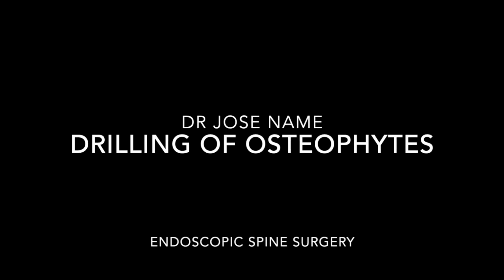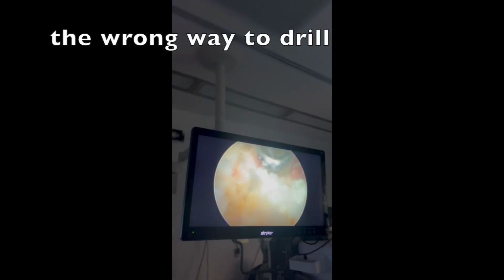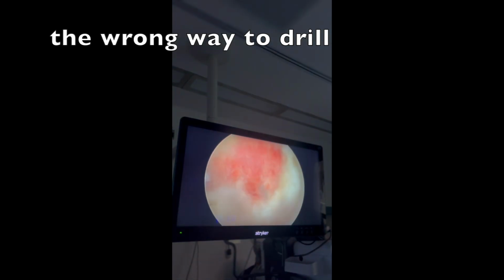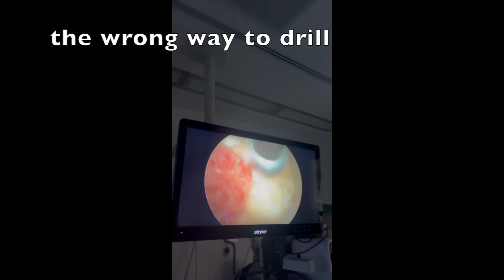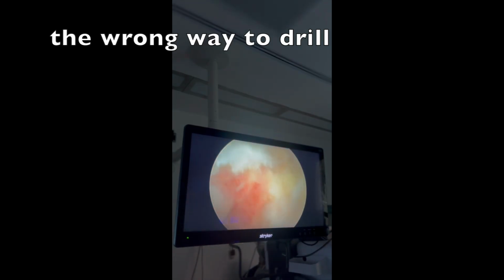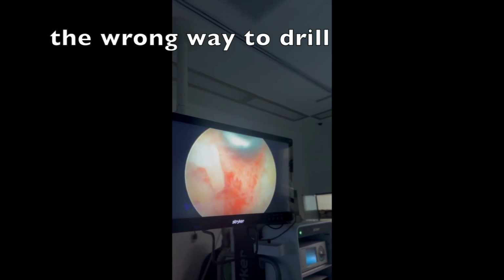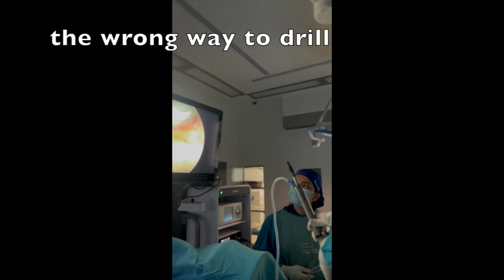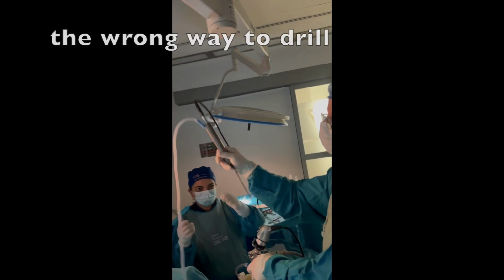I'm going to talk about how to perform osteophyte drilling when we perform endoscopic surgery of the lumbar spine. I start by showing this short video in which it shows the way I did the drilling previously, which occasionally led me to disorientation during the surgeries because sometimes the anatomy was lost. I performed a drilling of the bone from the surface to the depth, and many times I lost one of the most important anatomical landmarks when one does a stenosis surgery, that is the tip of the facet joint.